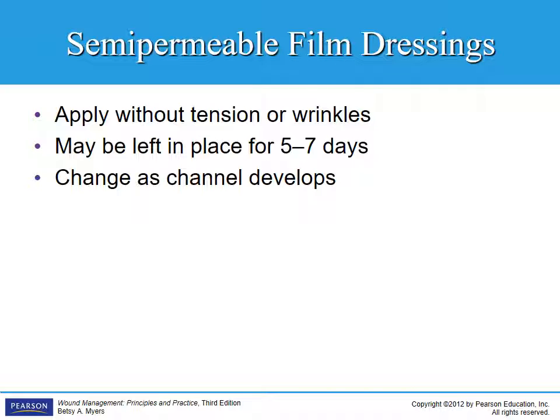Once you see a channel, meaning there's enough fluid buildup underneath the semi-permeable film that it starts to develop a channel underneath it, then you need to change it. You'll see semi-permeable film dressings a lot on skin tears. So if you're in a long-term care facility and you see someone with a skin tear, generally they have a semi-permeable film dressing over the top of it.